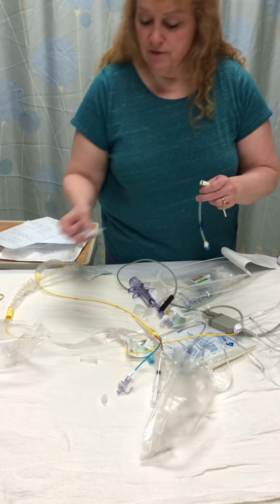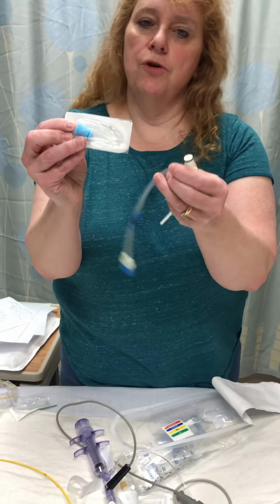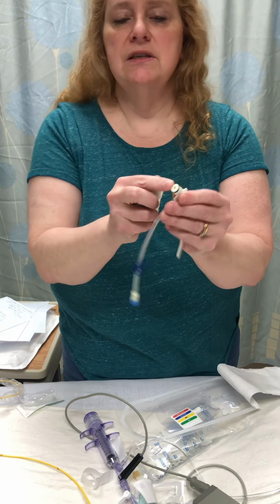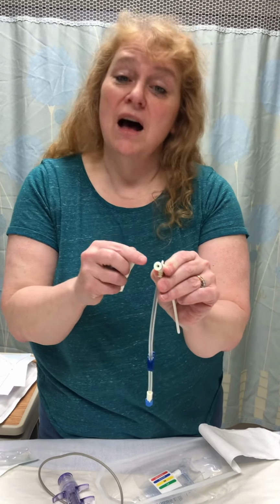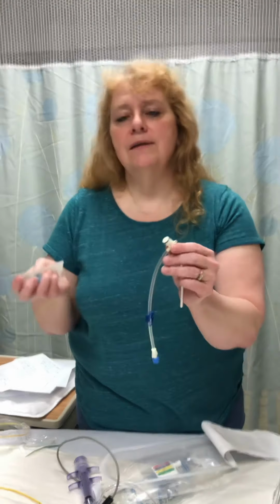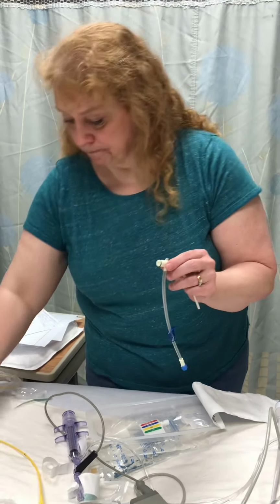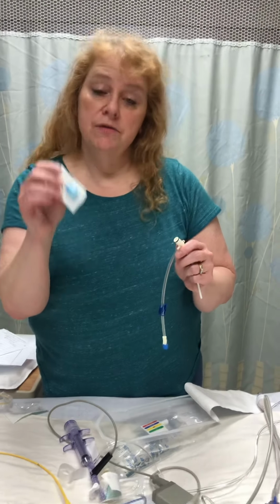With every swan, there is this little blue piece, and this is going to go over your introducer, just this little hole. In a perfect world, it is a one-way valve, and ideally things can't go in there once you pull out the swan, but just on the abundance of caution, we're going to put one of these blue caps on there.